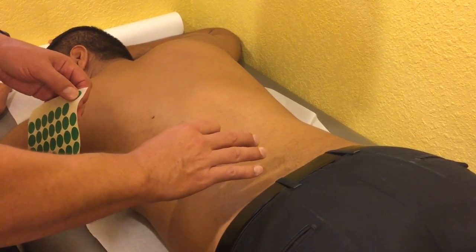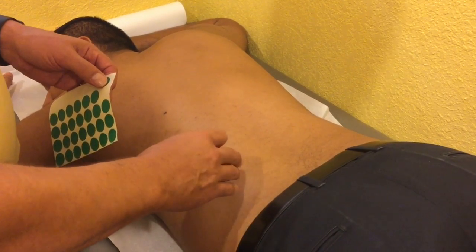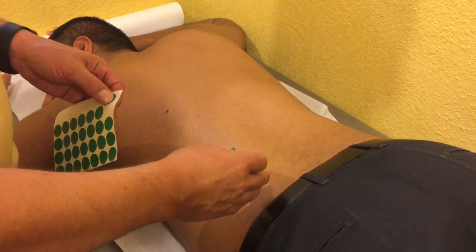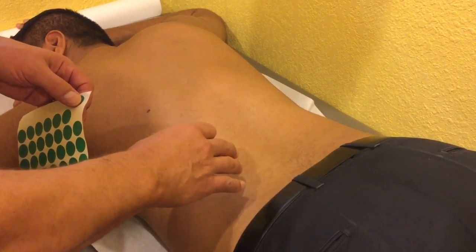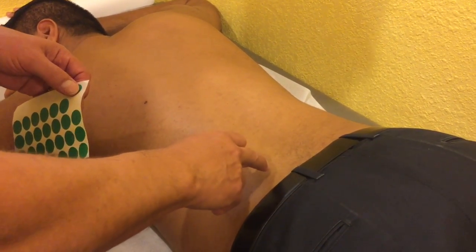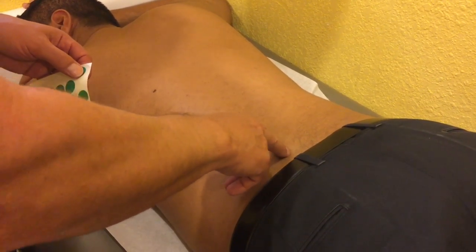So part of the setup process will also be to identify points to test. In this case, we're testing for tenderness and pressure points. So we're going to identify 2 symptomatic sites and 2 control sites. We're going to try to find a spot where the patient has the most amount of discomfort or pain. So we're going to test here.